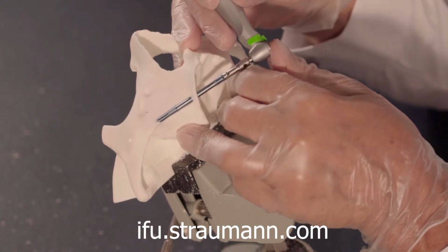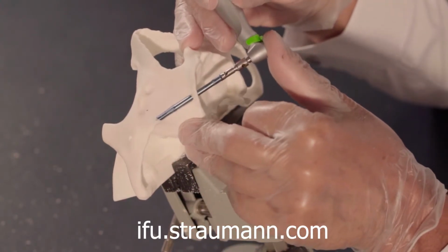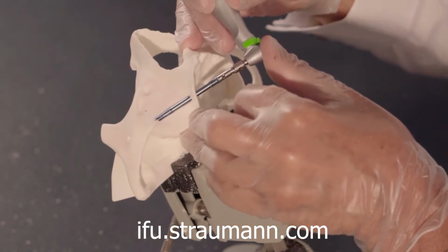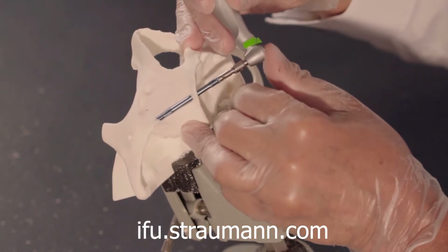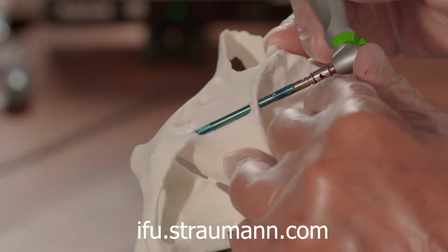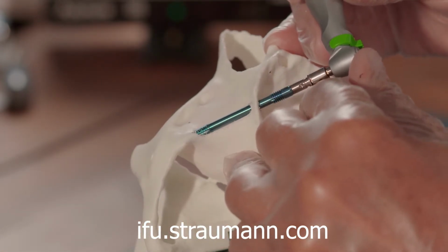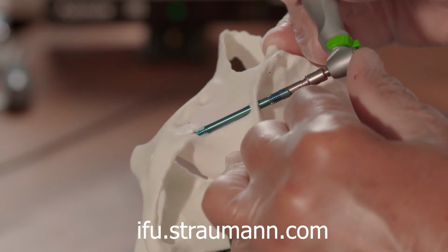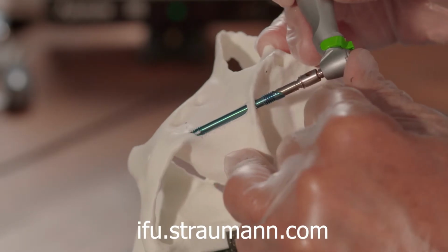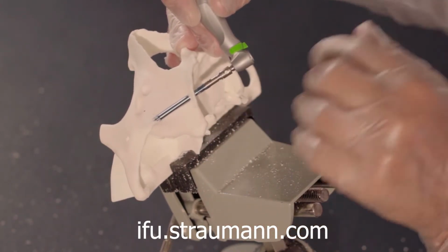So now we have 50 Newton centimeters. Again, one hand is maintaining direction, the other hand is pressing, and both hands have to be supported on hard tissue. No matter this is a plastic model, we have to use it as in a real patient situation. Very nice. So it stopped at 50 Newtons.